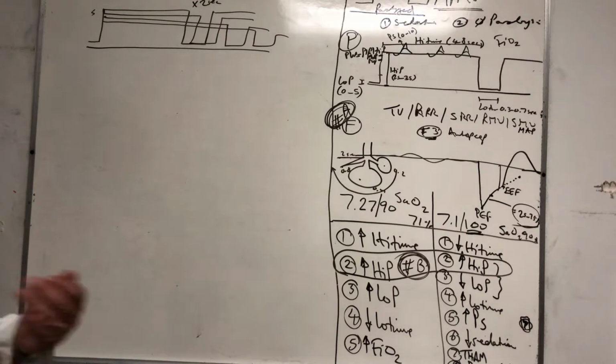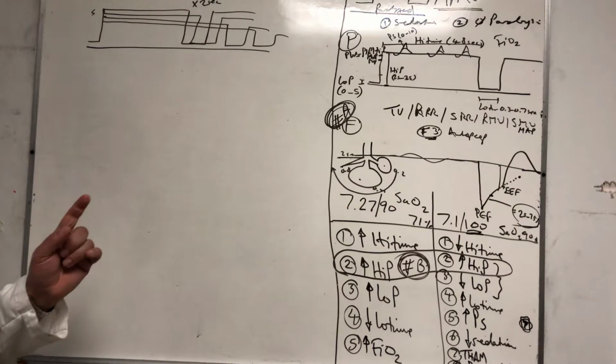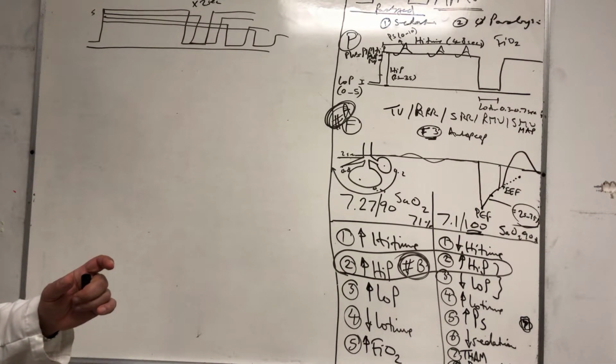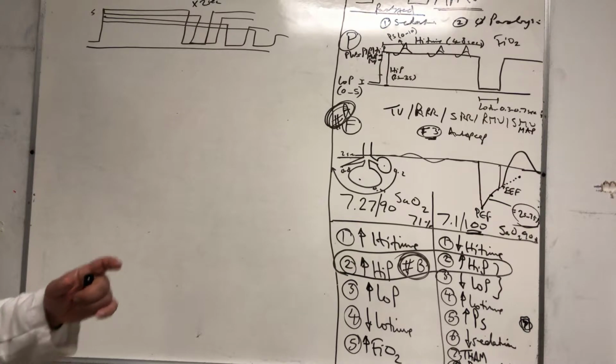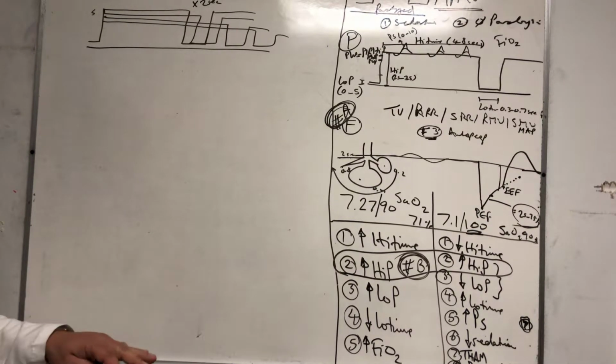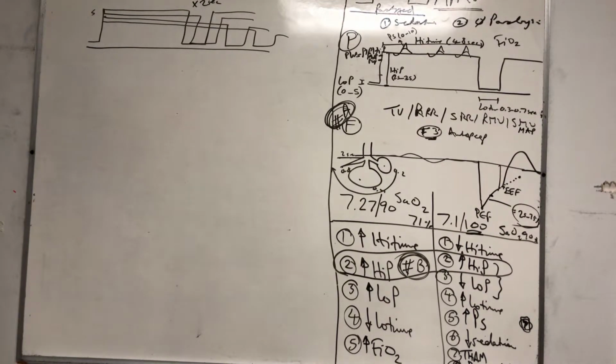So be malleable, be flexible, and don't be rigid here, because in this mode of ventilation you don't do an SBT every day, because you'll take the peak from 35 to 5 every day, twice. That's a disaster, right? So you cancel the SBTs, you just have to wean quickly. Sometimes I go three times a day. I'm thinking of changing the policy to make it every 3 times a day. But we'll see how it goes.